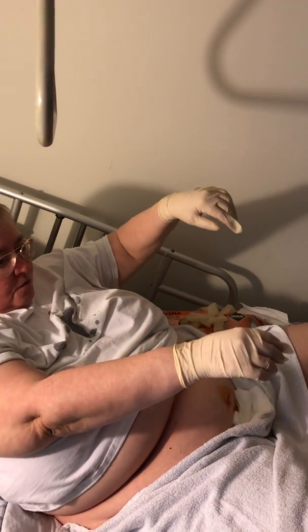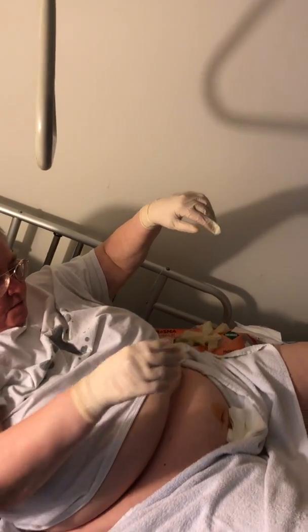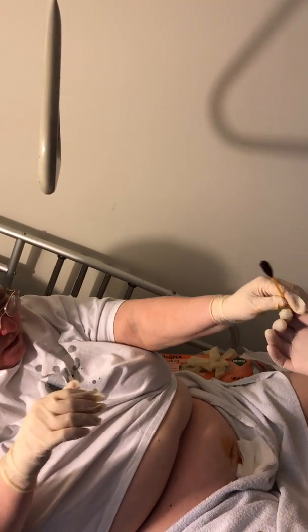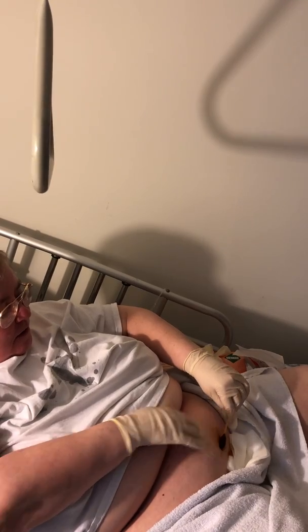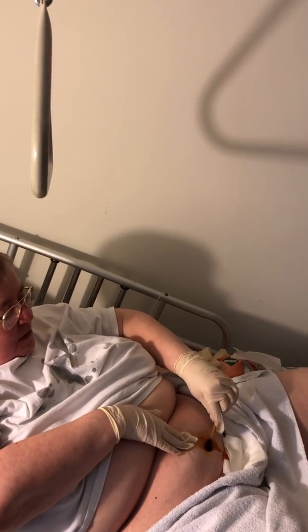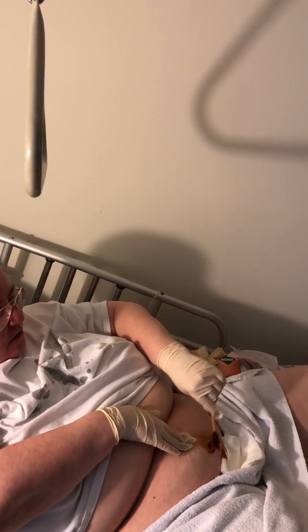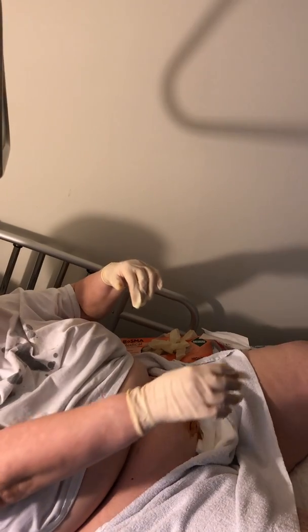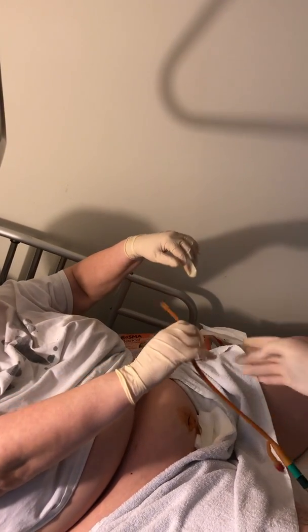Okay, Annie, start it for me, please. Iodine. Aim it for me. Yeah, oh, thank you. Am I in the right spot? Yes, you are. Okay. Yeah, there was some goo on it. Okay, start it for me, please.